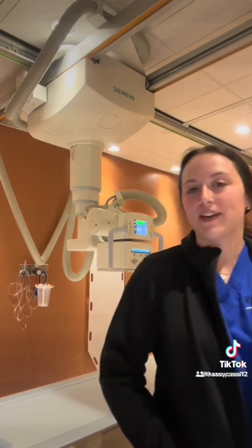So my name is Cassie and my pathology is osteoarthritis, and it affects mostly weight-bearing joints, so we'll be doing a knee x-ray. This is my patient Shelby. Before we get started with the exam, I made sure to ask Shelby if there was any chance of pregnancy, and she did say no.